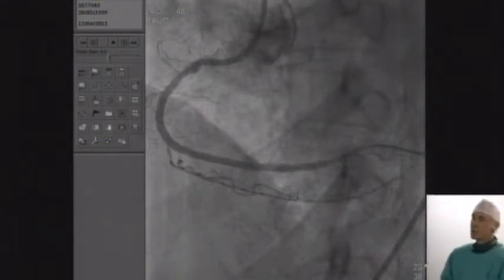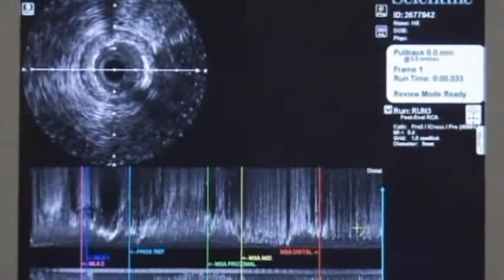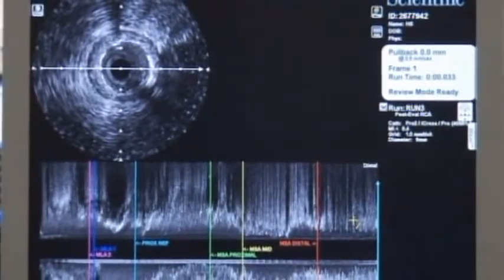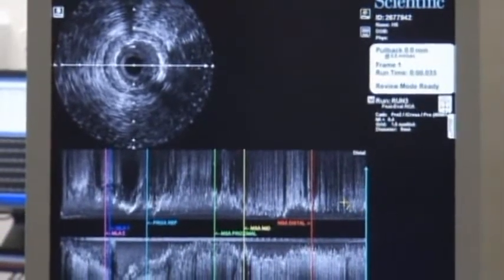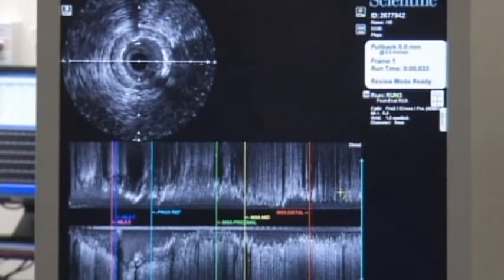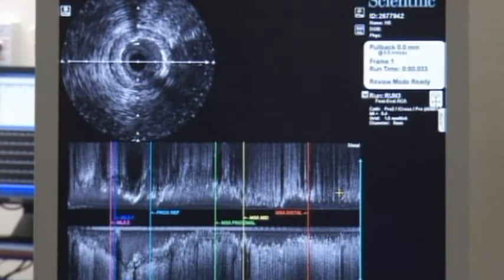Would you like to see the IVUS result now? The final IVUS of the right? Yeah, it's a full metal jacket. A reconstruction of the right. Rebuilding. With this design, the branches are really nicely preserved. I mean, when you look at the angio post all the stenting, you don't lose a lot of branches there. It seems that most of them are there.